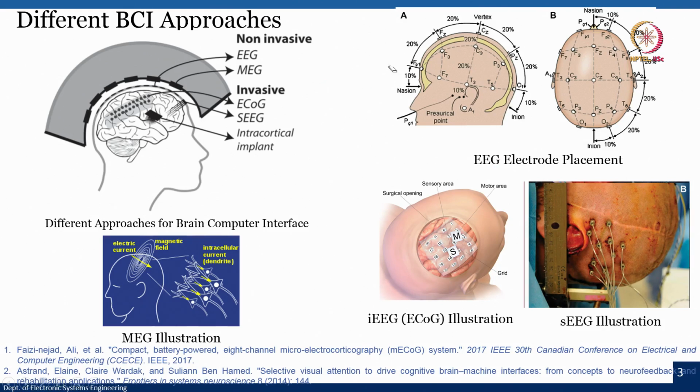Now, I said that there is something called intractable epilepsy. You can see here in this case there is a craniotomy. That means removing part of the skull, and when you remove part of the skull you will reach the dura. When you open the dura you will see the brain. The brain is floating in cerebrospinal fluid, and it pulsates. Now, if I place this microelectrode array on the brain and suture the entire thing back, then I can get signals from each electrode.